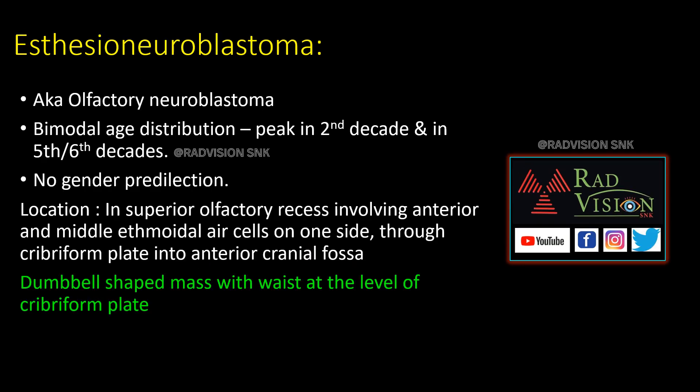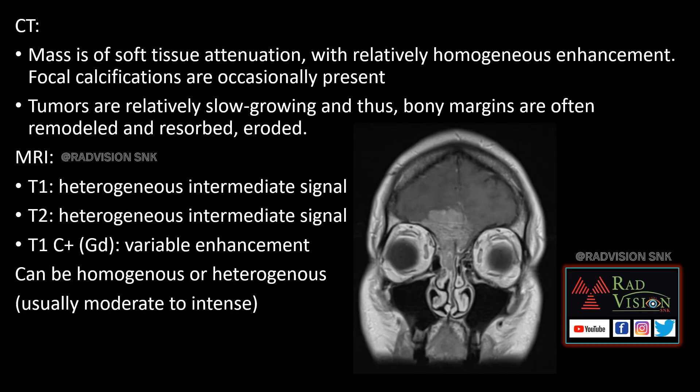Esthesioneuroblastoma has a bimodal age distribution. The most common location is at the superior olfactory recess, giving a dumbbell-shaped mass with a waist at the level of the cribriform plate. On CT, the mass is of soft tissue attenuation with focal calcification. Bony margins are often remodeled or eroded. On MRI, both T1 and T2 show heterogeneous intermediate signal intensity. On post-contrast, variable enhancement which can be homogeneous or heterogeneous is seen.